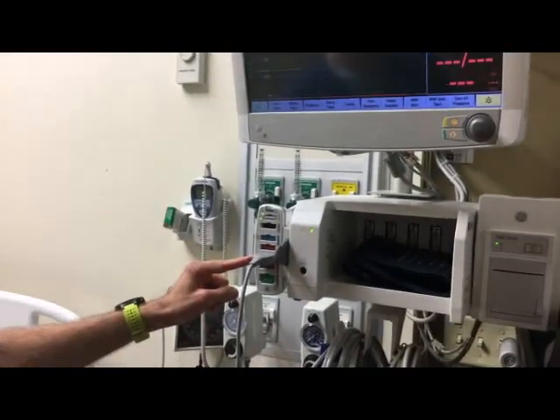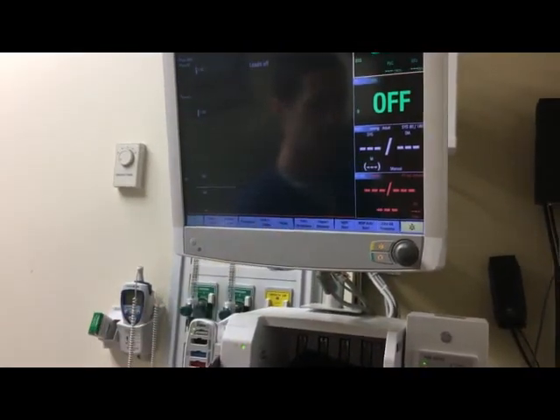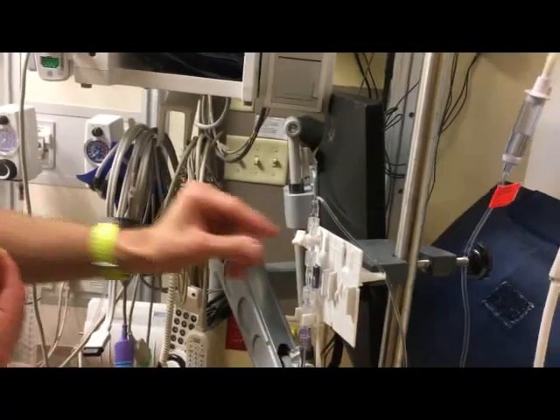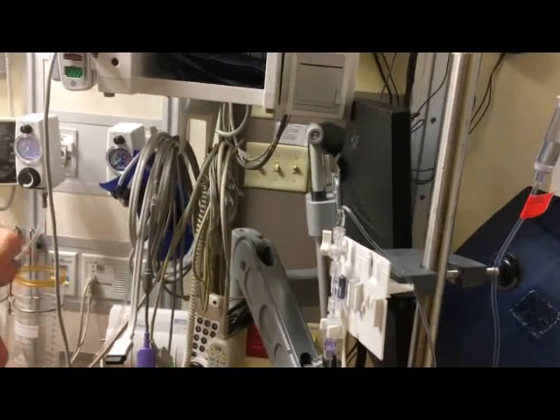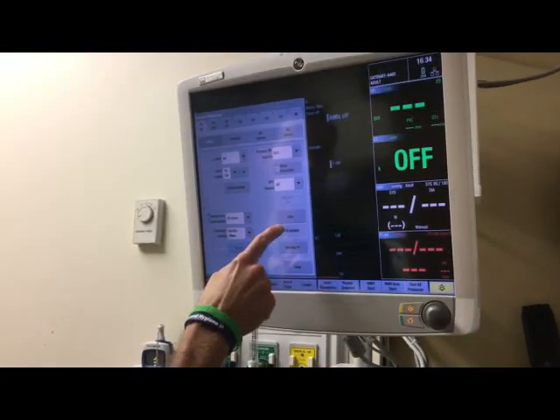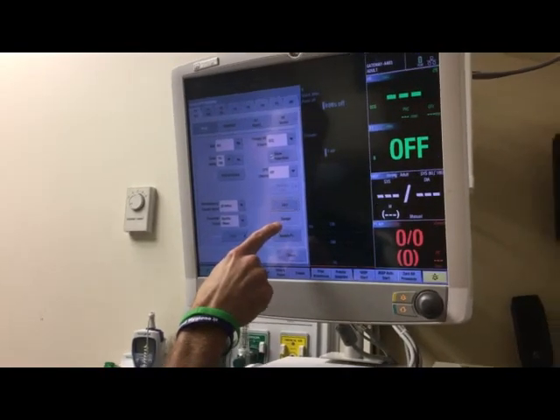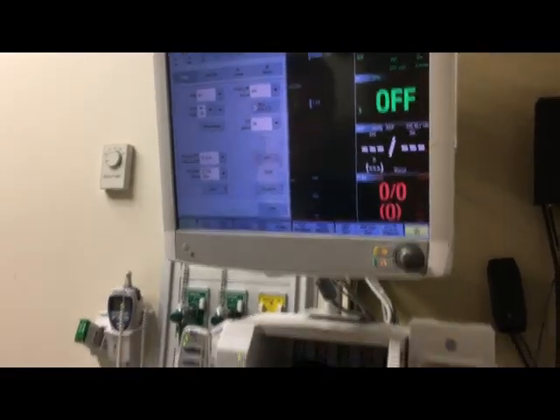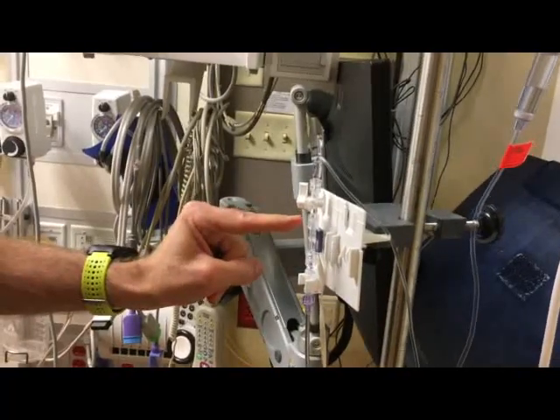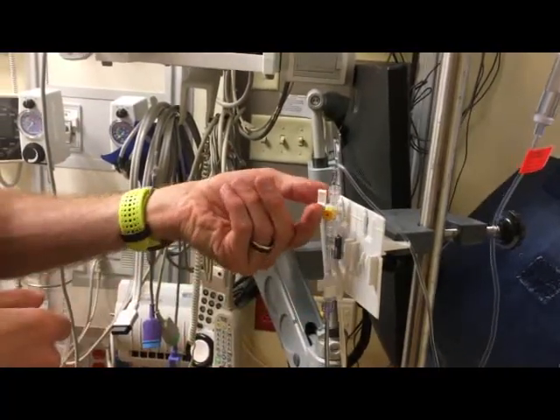With the red cable plugged into the second red port, you should see the arterial line appear on the monitor. Next, we're going to zero the line. At the transducer, remove the yellow cap and turn the stopcock off to the patient, which is up. At the monitor, select the arterial line and hit the zero button. You'll know the line is zeroed when 'zeroed' appears and the numbers go to zero. Back at the transducer, squeeze the fast flush to get air out of the air-fluid interface, apply a new sterile yellow cap, and turn the stopcock back to the right.